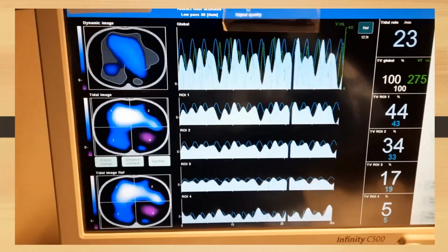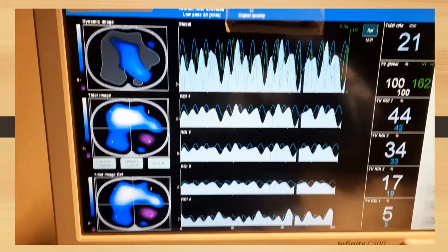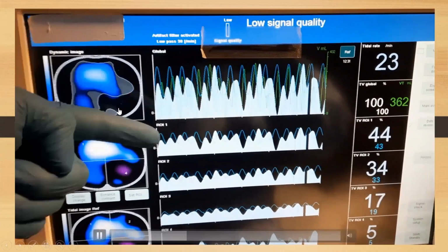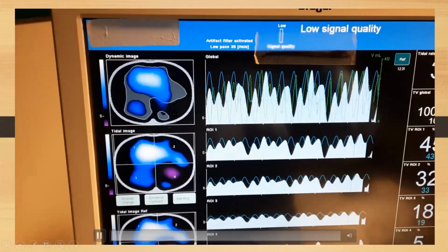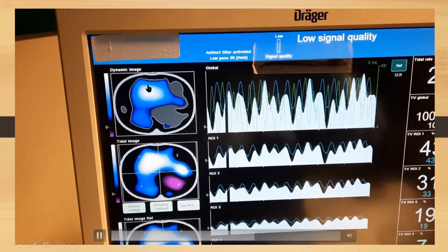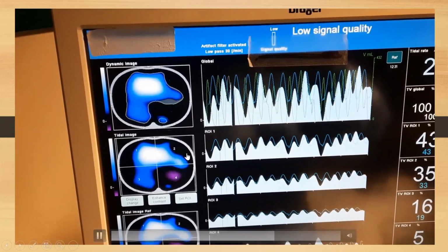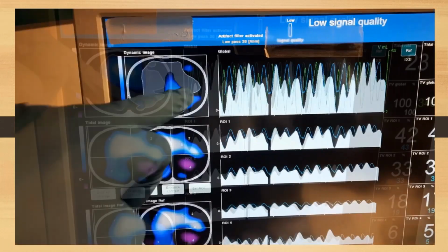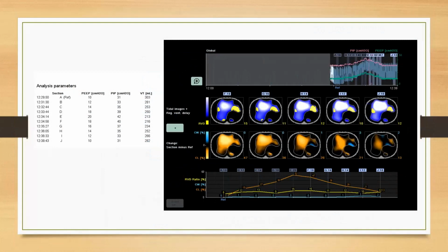You see over here that there's a possibility of some ventilation occurring here. So it's going sometimes down here. So we decided to try APRV, but before, the doctor wanted to try higher PEEPs, so we did a PEEP trial. And this is the PEEP trial here.